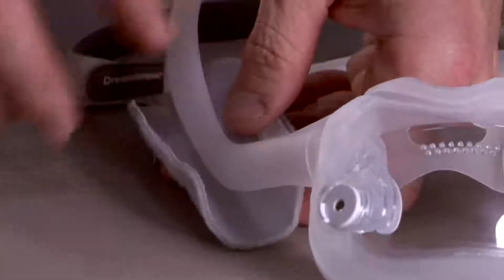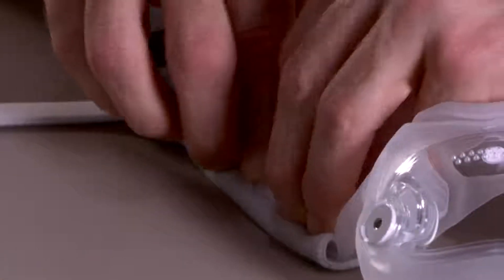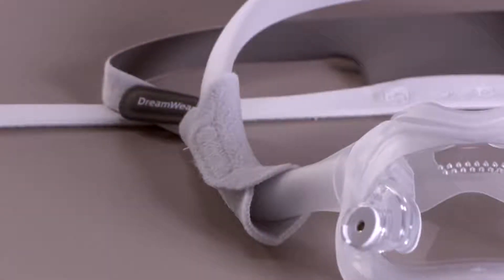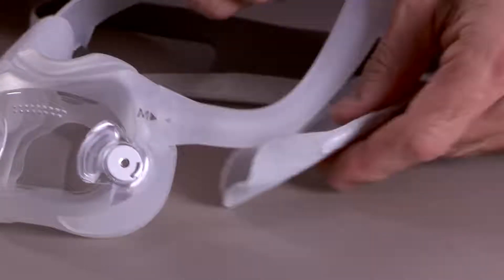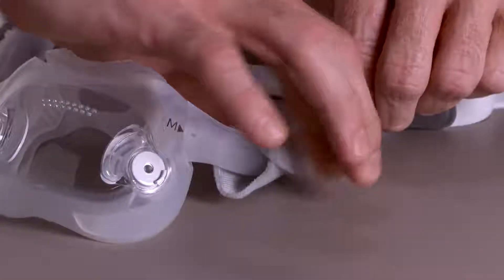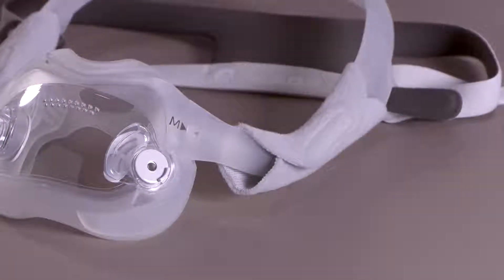As an option, you can add soft fleece wraps to the sides of the frame for a softer fabric interface between the mask and your face. Place the wraps around the frame between the headgear tabs and the cushion, making sure the Velcro attaches on the side that is away from your face.